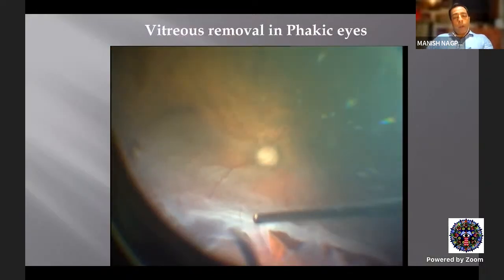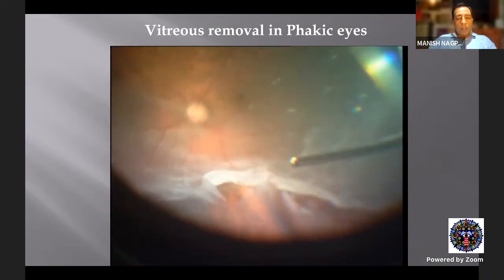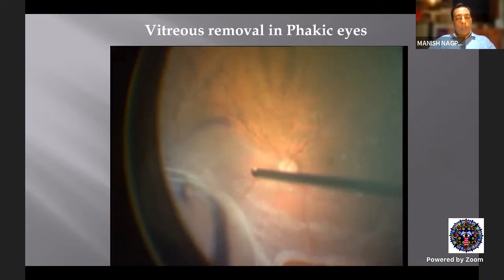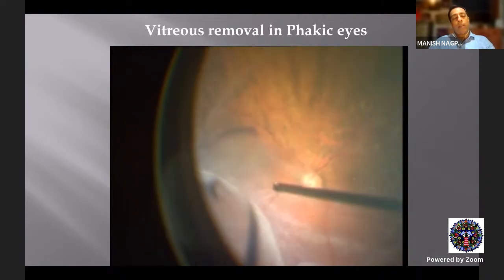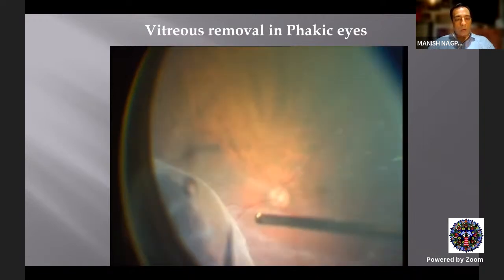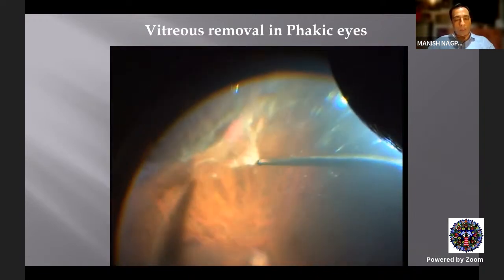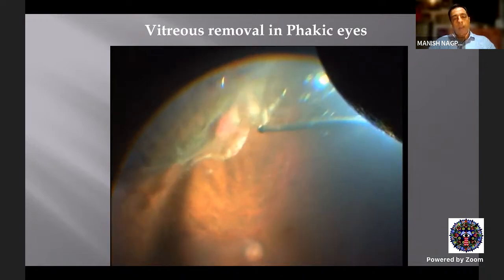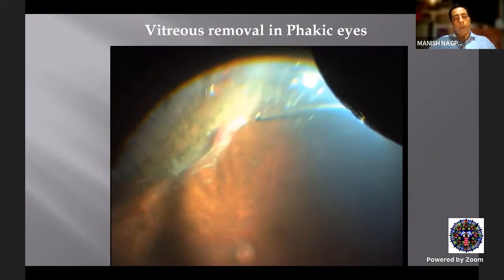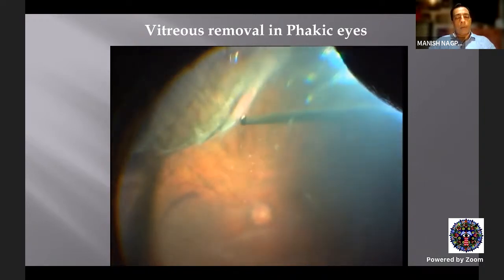For vitreous removal in phakic eyes, just a tip that I wanted to give you: in these cases, because you're saving the lens, you want to shave the periphery. So here you want an external indentation. You could either have a very good assistant who can do it for you, or you have a chandelier light like I've put in this case. And then I use my other hand to indent with an indenter and bring the peripheral retina closer to the posterior area, to the central part.